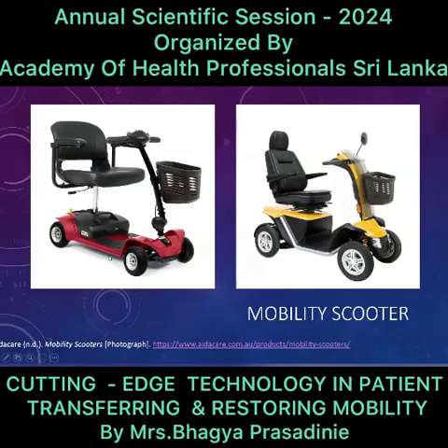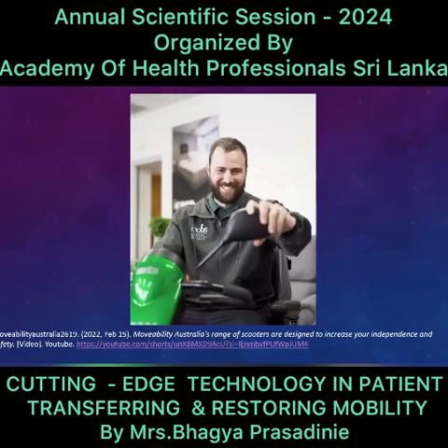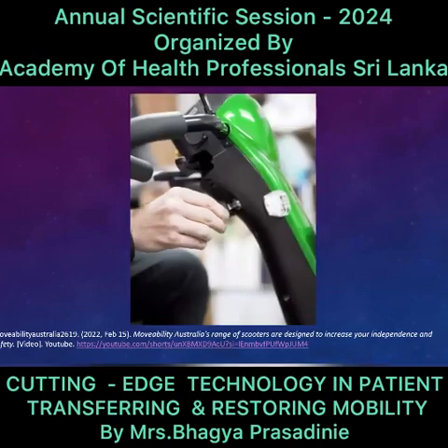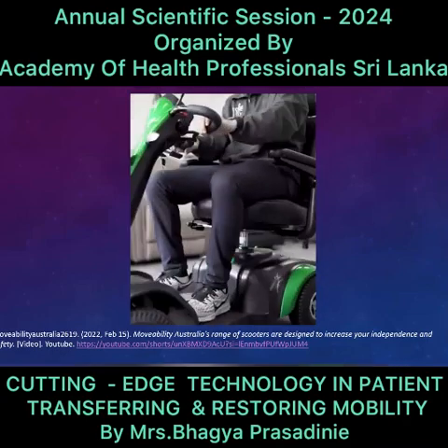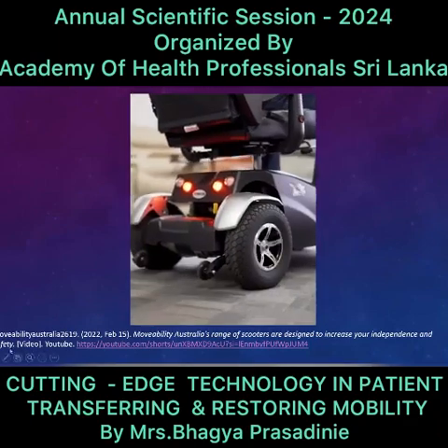So these are the mobility scooters, much more similar to the powered wheelchairs. The difference is usually the mobility scooters have more range in performing the movement. And this is quite good when you are mobilizing on the road. It's just like a normal bike we ride. We have mirrors to see both the sides. So you can hover and navigate it to anywhere you want.